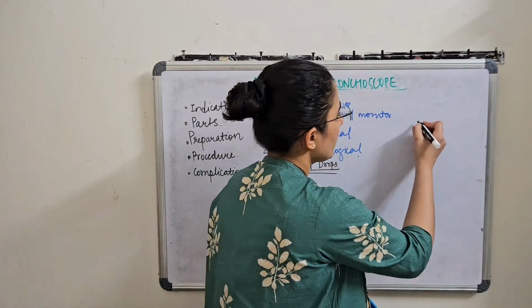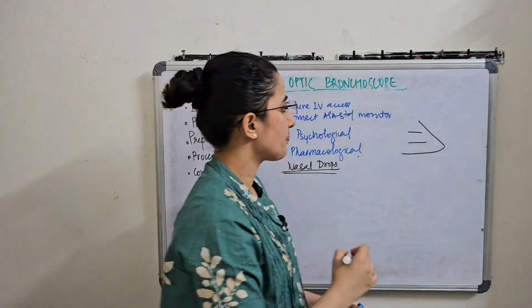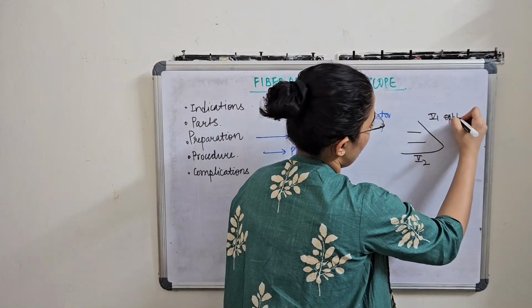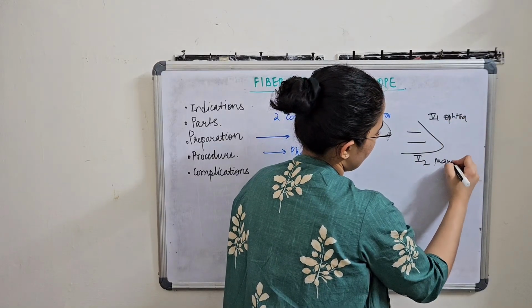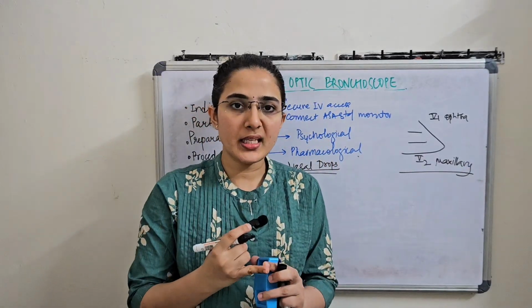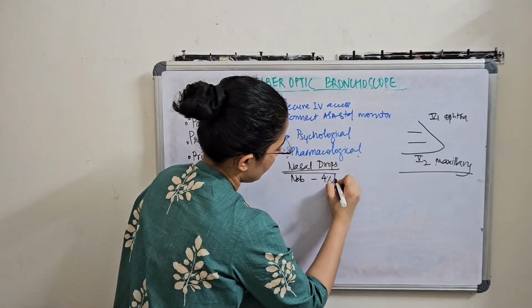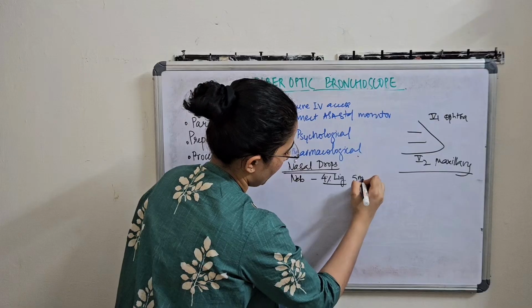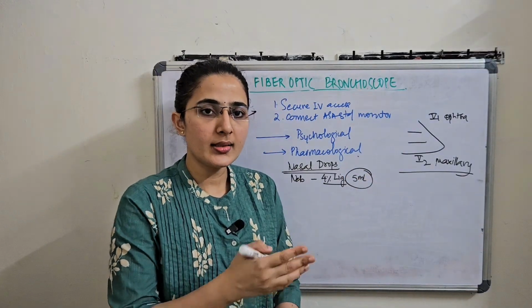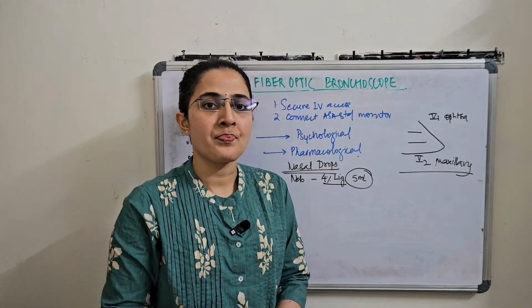We have to remember that the nasal mucosa is innervated by the first and second branches of the fifth cranial nerve, that is the ophthalmic and the maxillary branches. The nasal mucosa can also be prepared by using nebulization, with about 5 ml of 4% lignocaine. That also helps in providing good analgesia as well as a good numbing effect on the nasal mucosa as well as part of the oral mucosa.